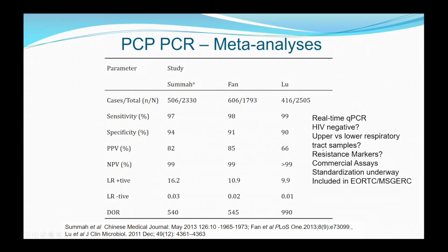Of course, we also have real-time qPCR that gives us a quantitative result. This helps us interpret the significance of a positive PCR result. And the higher that burden, the higher the specificity.